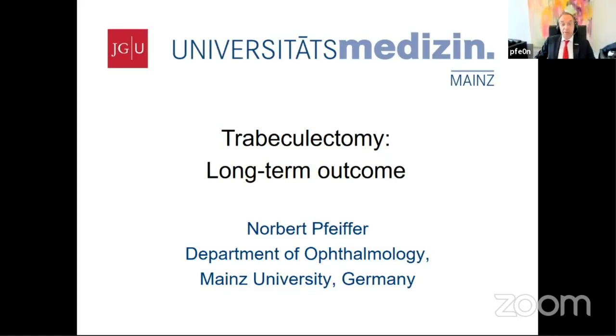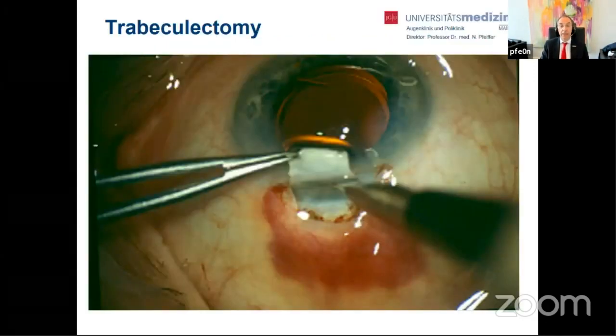You've heard a lot about MIGS and other things, and I think we've just also heard that trabeculectomy is still a very good method. My task is to present you the long-term outcome of trabeculectomy. When you talk about trabeculectomy, we must also define what we understand by trabeculectomy. So this is what it looks like during the surgery. And I would like to show you 10 years results in a few minutes.